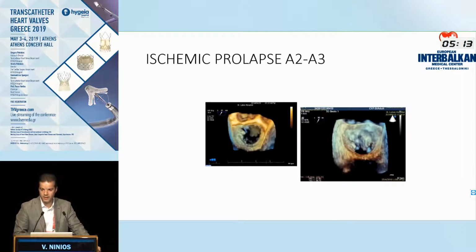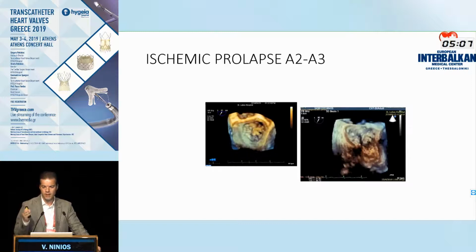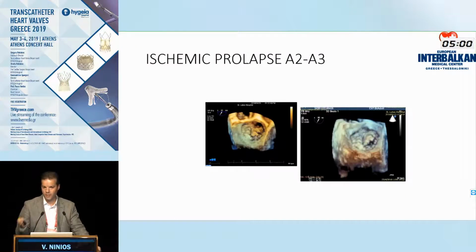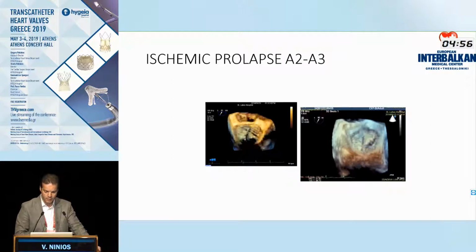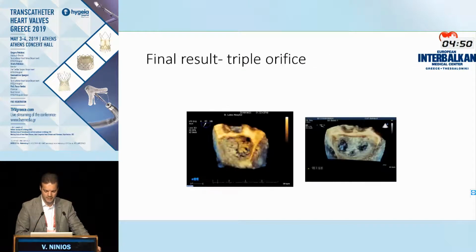2 clips were enough on this patient, and this is usually the case when you are treating commissural prolapses, because the tissue there is shorter and there's not excessive tissue in the A1P1 or A3P3 area. Usually 1 or 2 clips can actually deliver what you need, like this case, for example, with a prolapse of A2, A3, and pretty much you can predict on this patient that 2 clips will be necessary.